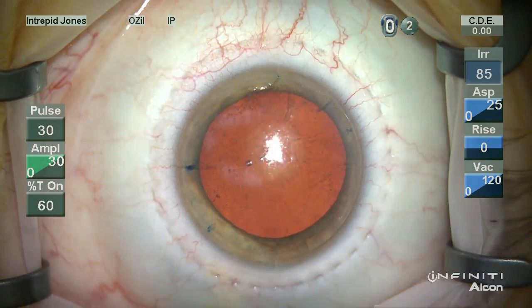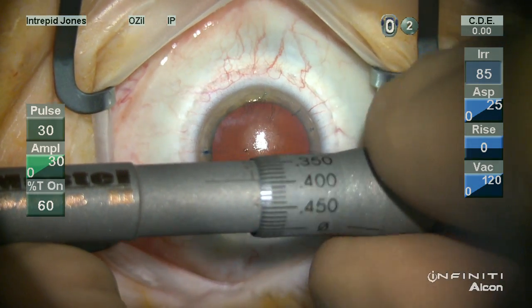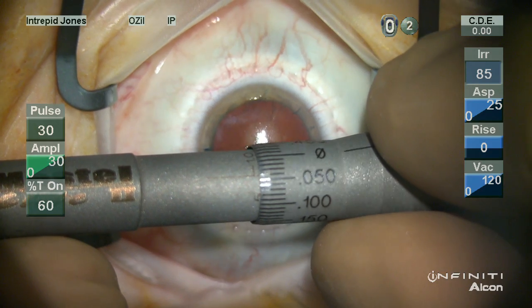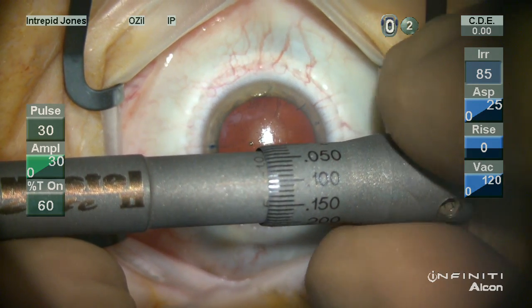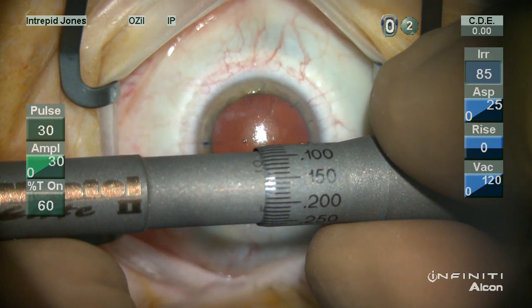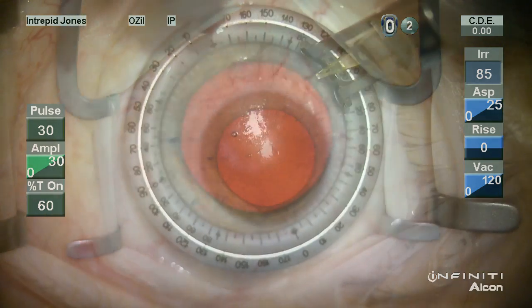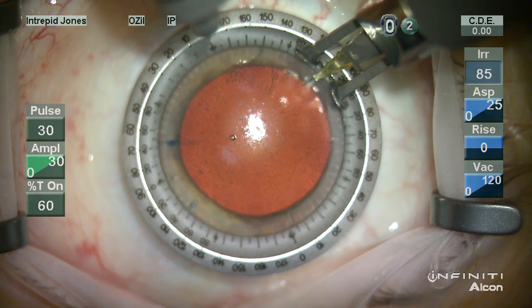It's important to look at the zero mark to ensure that your blade does not extend beyond the footplate prior to advancing the blade to the desired depth. It's also important to rotate the barrel up to the desired depth marking and not go past it. If you've gone past, go back down and come back up.